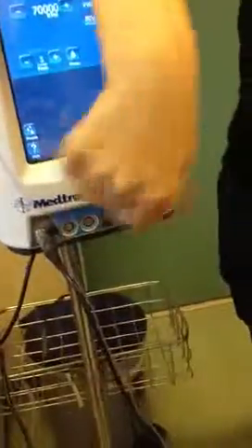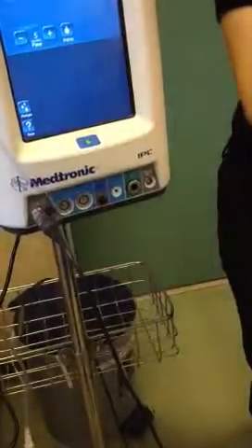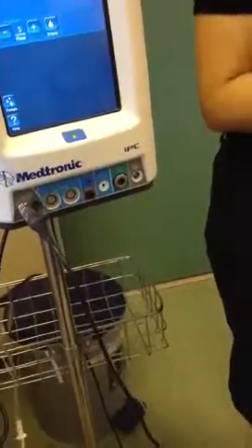Just now I mentioned how you remove this: push in and pull out. This coupling, push in and pull out, and all the attachment ends have pins. So always align properly. Don't twist it, otherwise the pin inside gets spoiled and the whole handpiece has to be sent for repair, right?